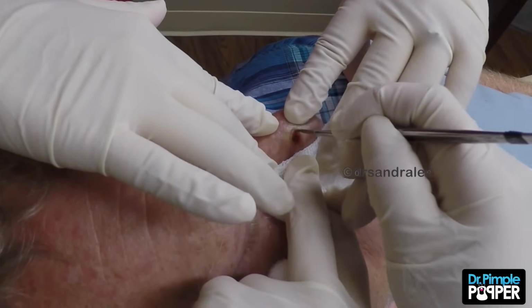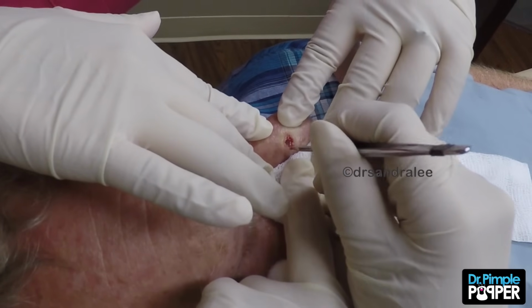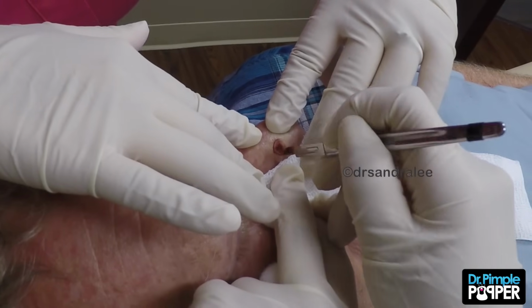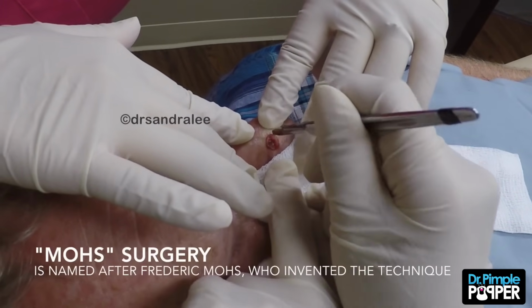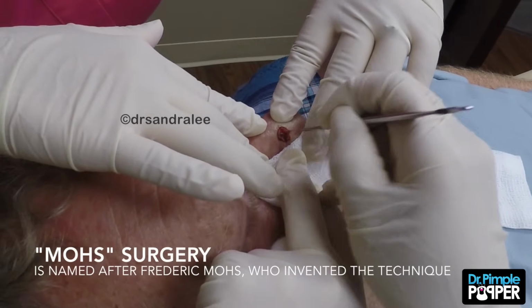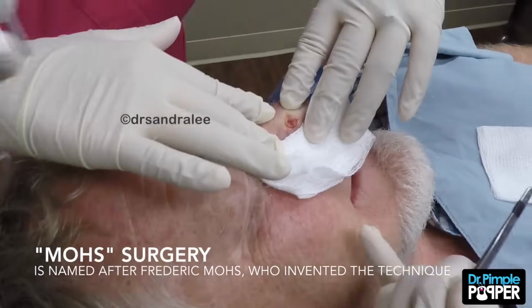We're taking our first layer here in Mohs surgery. Hopefully it's our last. You feel nothing sharp, right? Nope. Okay, good. Doing just great. So what is this Mohs? This is a special technique where we take as little as possible because we can check the tissue while you wait. So I'm going to take off what we see here, and then we're going to check it.